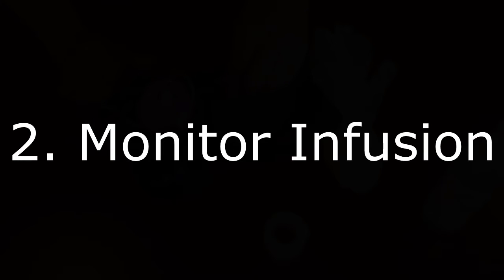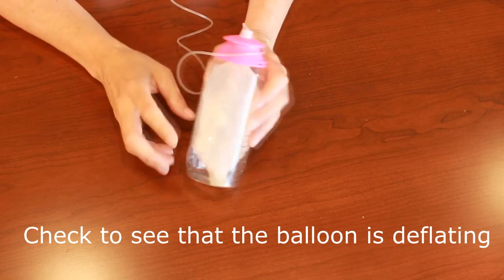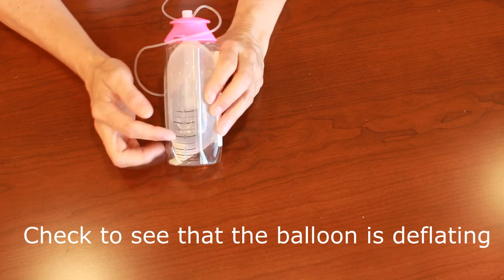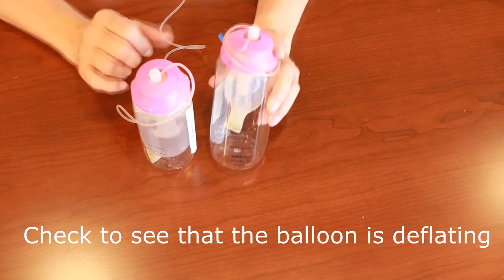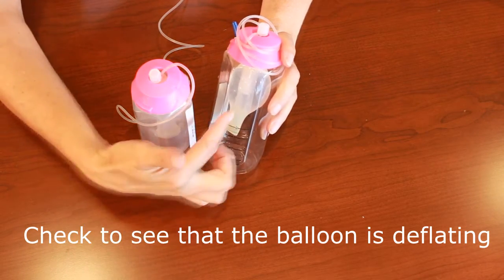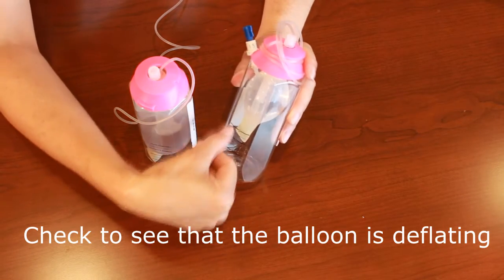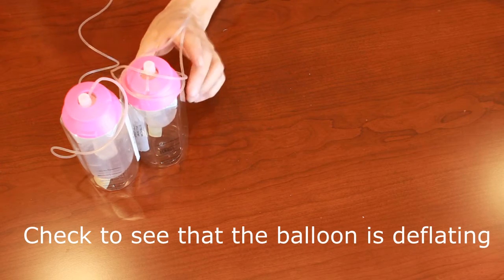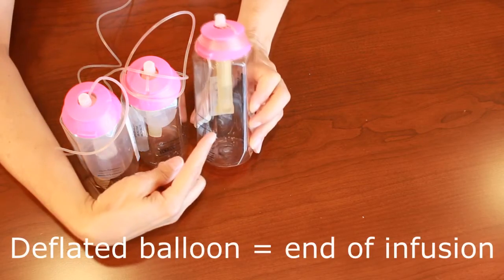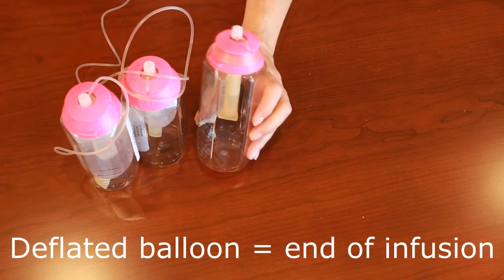You have a responsibility to monitor the infusion of this device to make sure that the balloon is deflating or shrinking. You can look at the device to determine if the balloon is shrinking. There are graduated markings on the side of the pump to assess that your infusion is progressing. This is what it looks like when full. Here's a pump that has only about a quarter of the infusion remaining — you can see how the balloon has deflated significantly. You'll know the infusion is complete when the balloon is completely deflated and you can see the little bumps on the inner tube of the elastomeric device.